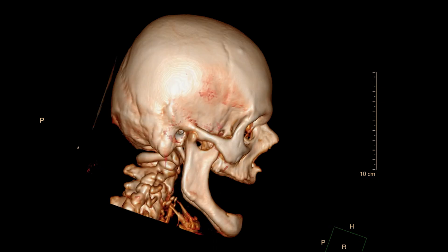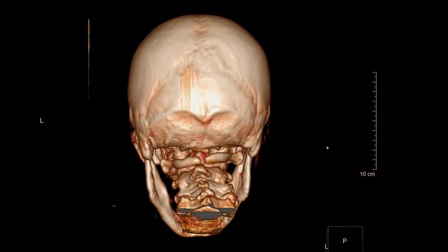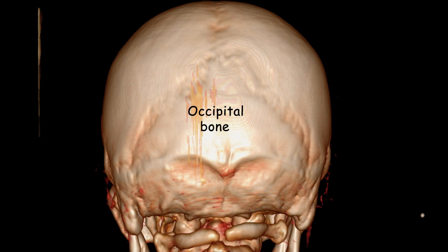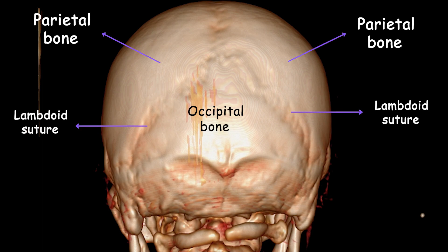Now let's shift attention to the back of the head, where the occipital bone can be seen. The occipital bone is a single bone located at the back and lower part of the skull, forming the posterior aspect of the cranium. It is a large, flat bone, roughly trapezoidal in shape, consisting of a squamous part and a basilar part. It plays a vital role in protecting the posterior part of the brain, supporting the skull, and providing attachment sites for muscles involved in movement and stabilization of the head and neck. The occipital bone attaches to the parietal bones at the lambdoid suture, visible on both sides of the skull.